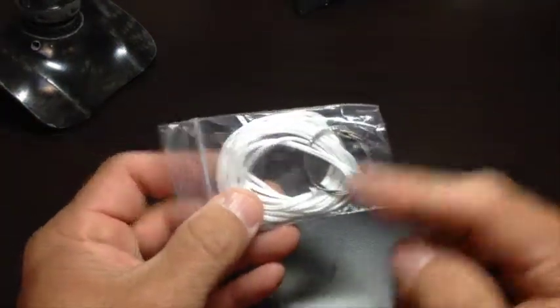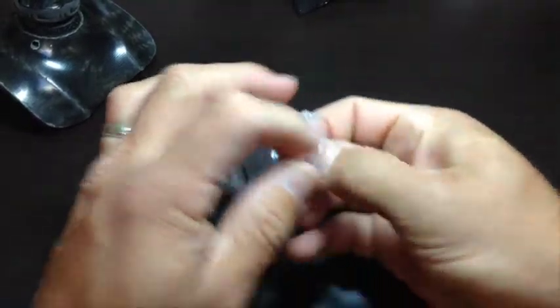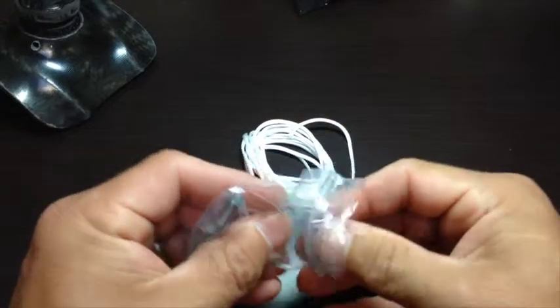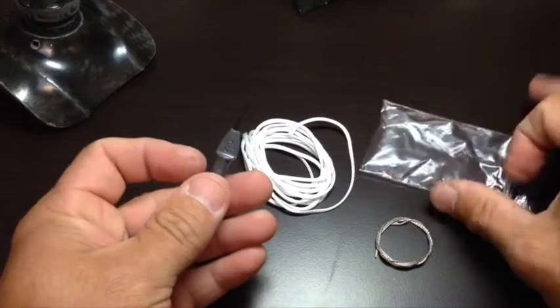Included with every ReboLim system is an additional filament replacement kit. Inside of this filament replacement kit is the filament, the threading tool, and the multi-purpose Torx tool.